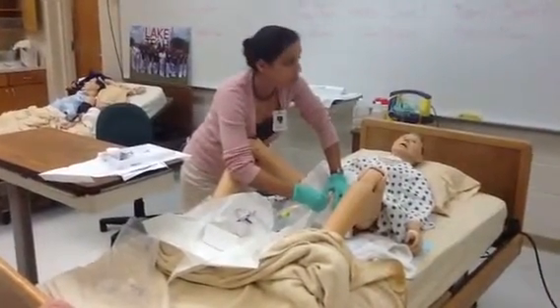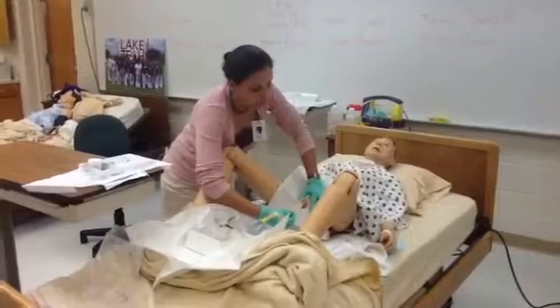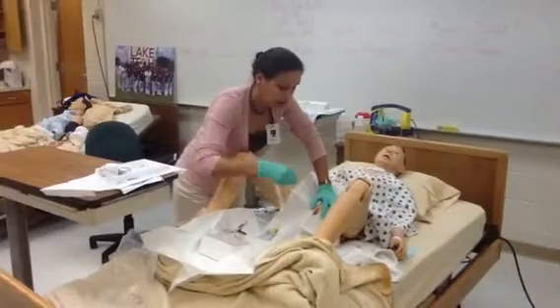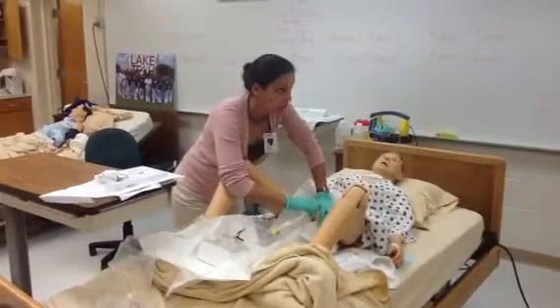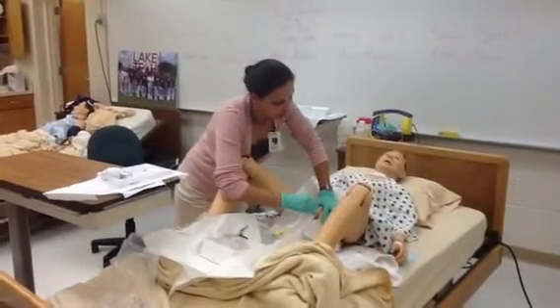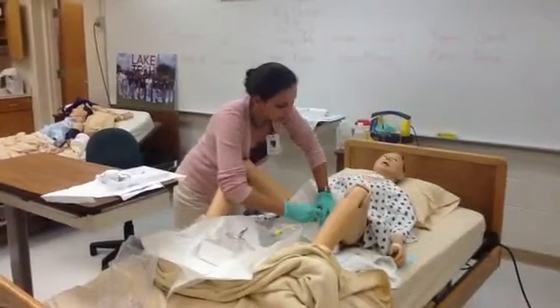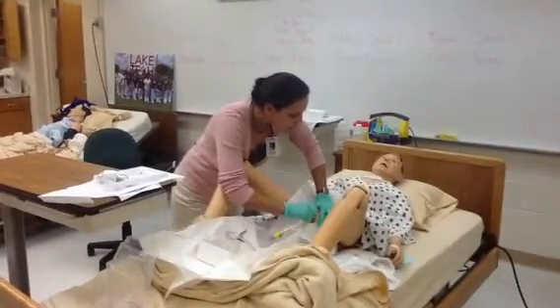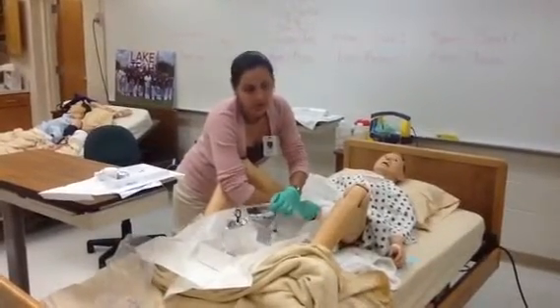In a real person's urethra, you should approach at a 30-degree upward angle. Okay, these mannequins are different because you have to approach at, let's see, 30, 90, almost like 180 degrees south, okay? But what you want is 30 degrees north for a real human, okay? And you're going to go right into the urethra, and what you are hoping to see is urine return right here, right at this area, all right?